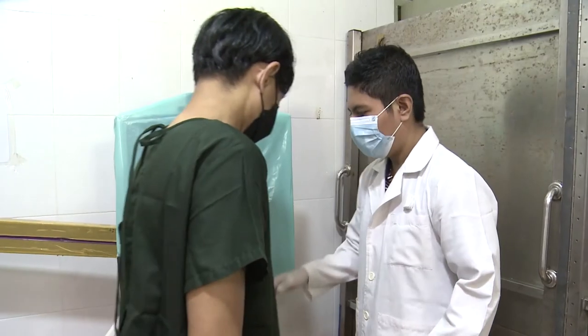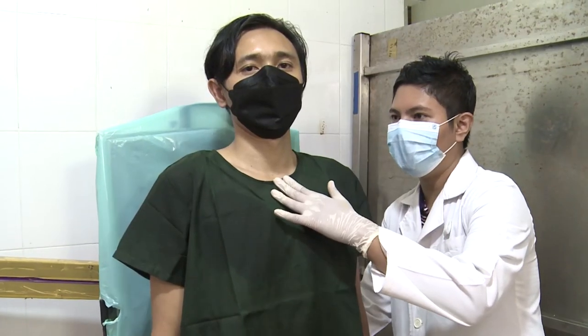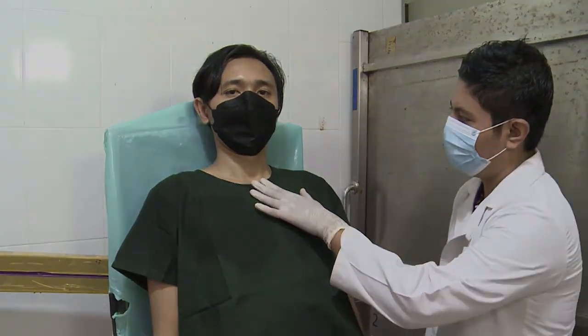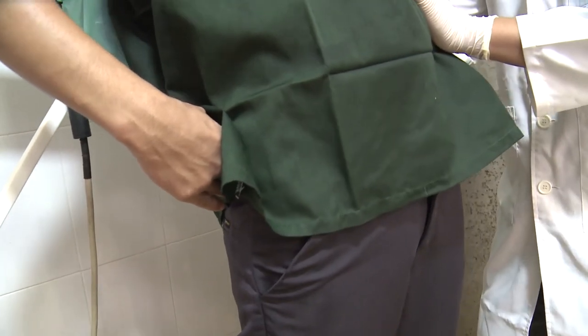4. To take a chest x-ray in the AP lordotic position, have the patient stand upright with their back against the IR plate. Ask the patient to take one step forward, then have them lean back and rest their shoulders, neck, and back of the head against the IR plate. Check that the upper border of the IR is approximately three inches above the patient's shoulder. Have the patient raise their chin to prevent superimposing lung apices. Direct the CR at 15 to 20 degrees cephalic angulation from the nipple line and position the CR at the nipple line. Check that the alignment of CR and IR are centered. Place both of the patient's hands on their hips and have their elbows bend back toward the IR as much as possible. Place the right or left marker in the upper corner of the IR. Collimate the four sides of the lung fields. Ask the patient to not move, then go to the control panel to take the x-ray.